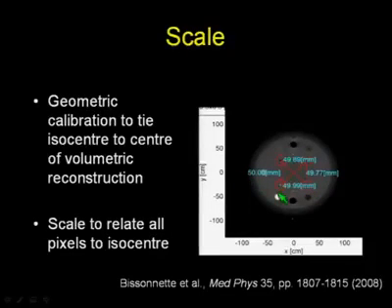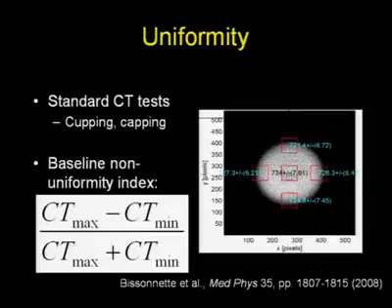Again, we have in-house reconstruction software that will assess that distance using the pixels, and hopefully these should be in agreement. Another thing that we look at is uniformity. Going to the uniformity section of your phantom, one can interrogate the pixel values at the center and at the edges of the image, and compare the mean and standard deviation of all of these parameters.